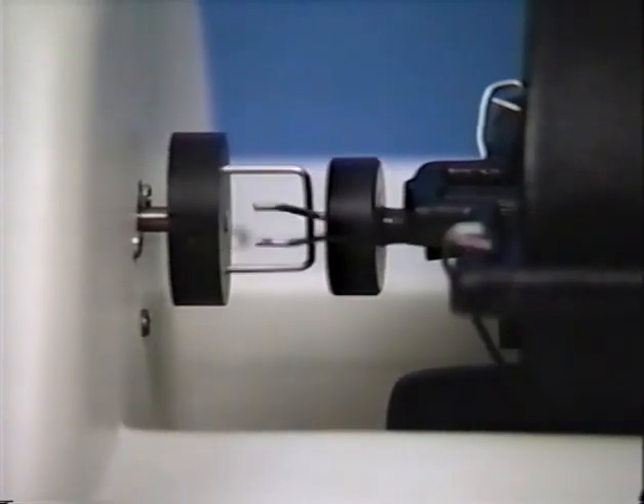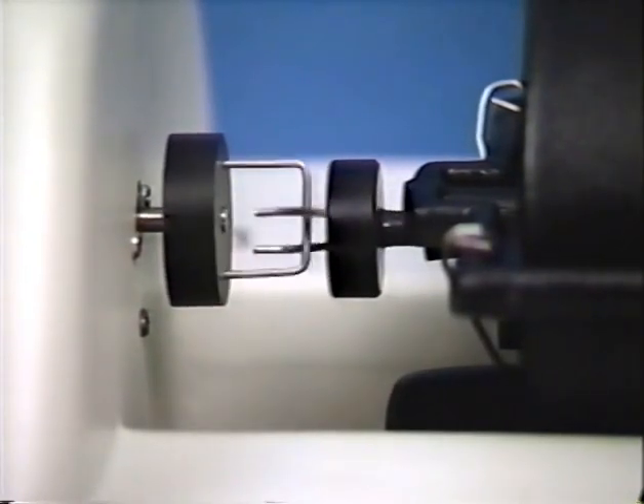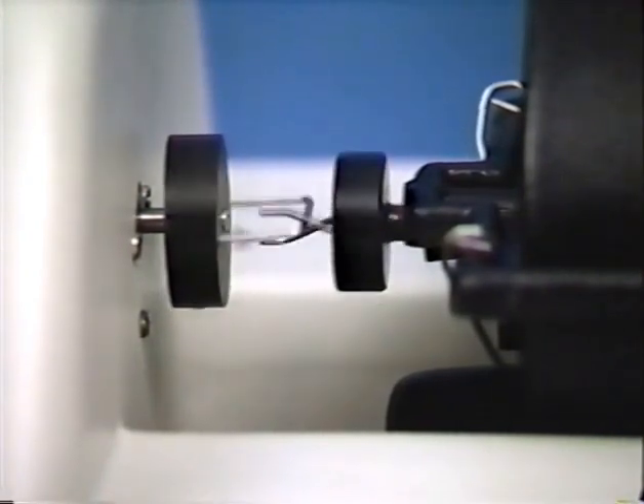As the film is being processed, the rotating spindle agitates the film with a back-and-forth rotation coupled with an in-and-out motion to provide extremely smooth and even agitation.